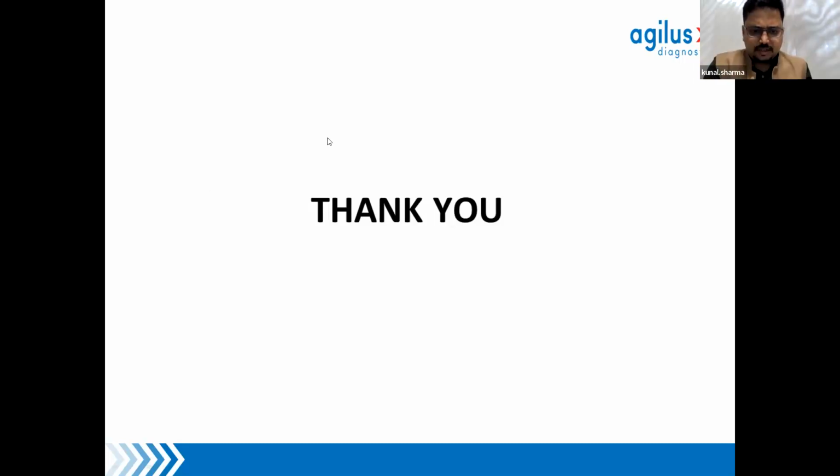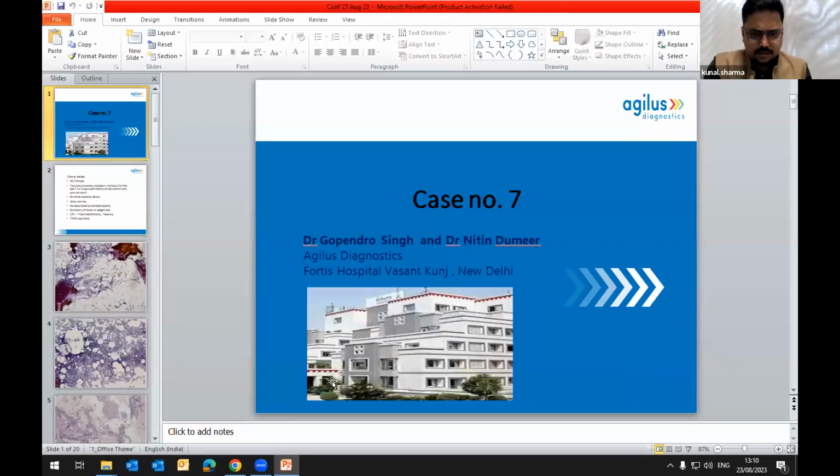There are a few questions. I think somebody has written if they wanted to see BCL2 again, but I think Dr. Jofi has answered it very well. I will believe if you said BCL2 was positive, but people should know that BCL2 negative follicular lymphomas also exist. IGH BCL2 translocation might not always be seen.